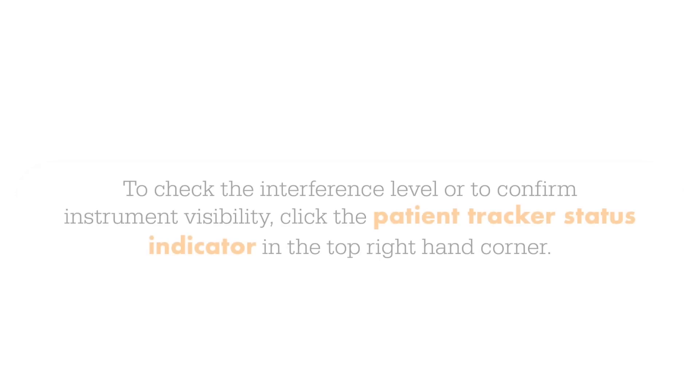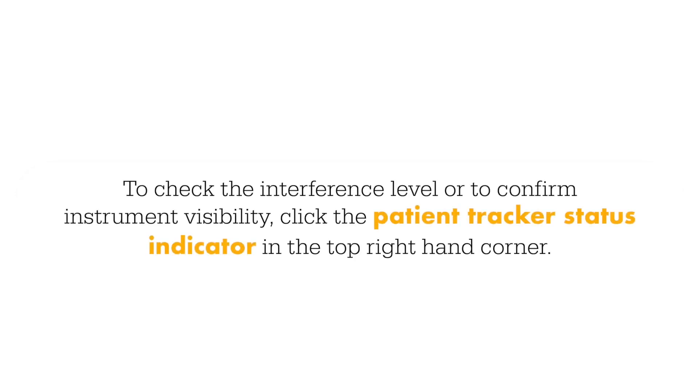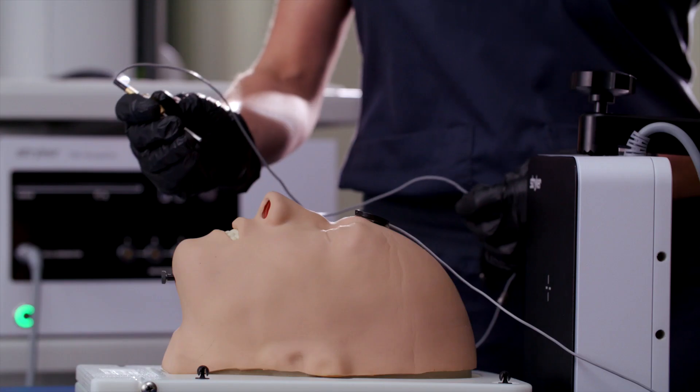A progress wheel indicates the progress of that step and an audible beep serves as a confirmation tone for when that step has been completed. To check the interference level or to confirm instrument visibility, click the patient tracker status indicator in the top right-hand corner.